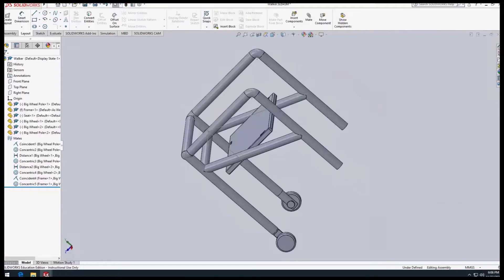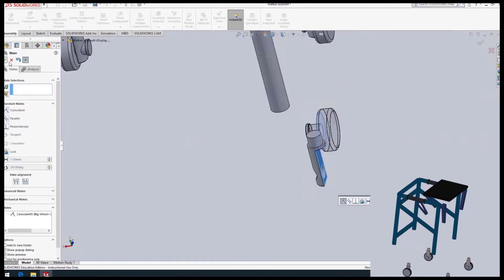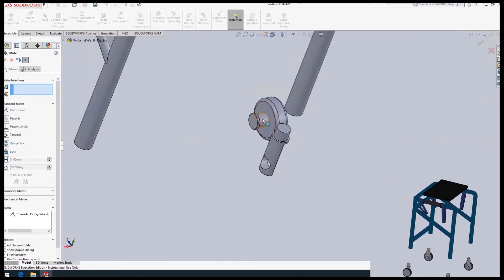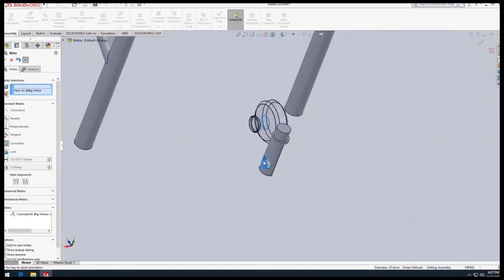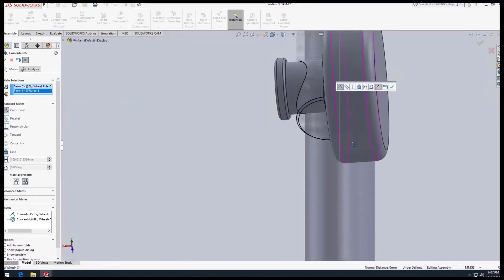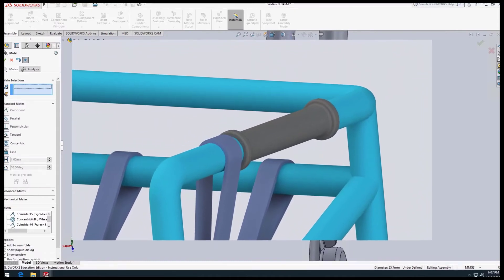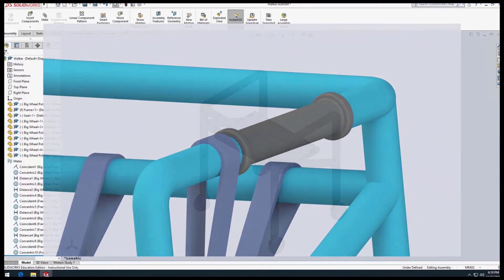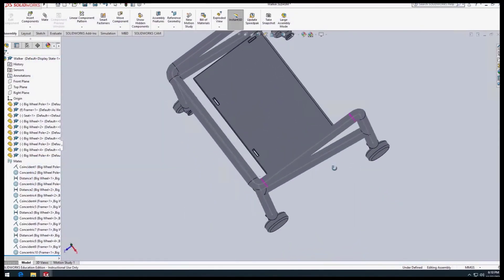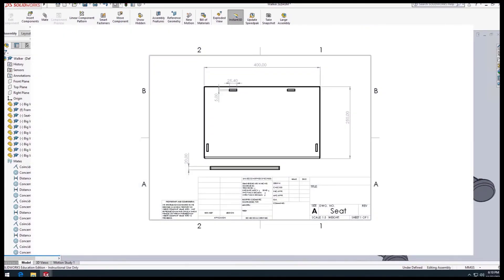Once all the individual parts were made to scale, it was time to assemble everything. Once we added everything to the design, we noticed that some placements had to be changed, including the handles. We saw that the handles were unnaturally forward and wouldn't be comfortable to reach, making it harder to support oneself. We moved them back to a more natural and intuitive location. Once everything was assembled and the design felt adequate, we converted everything to a drawing with dimensions and began the manufacturing process.